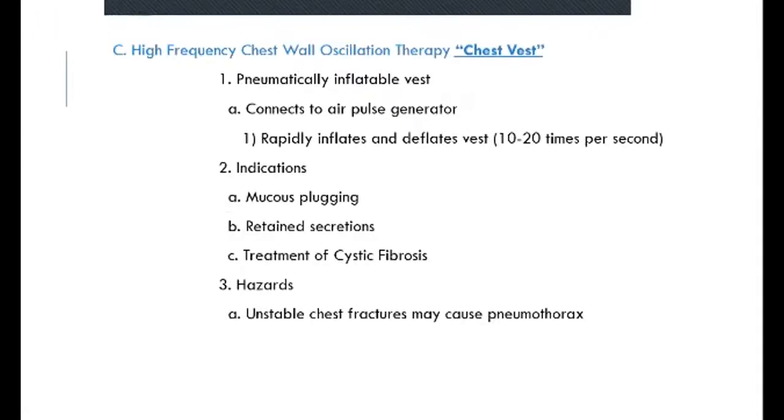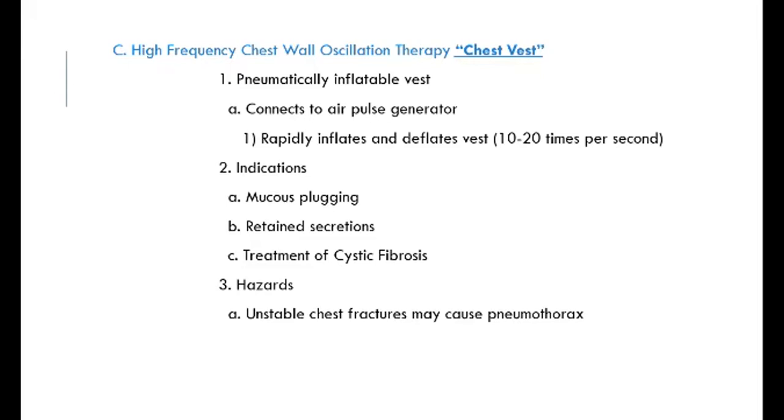Now, high frequency chest wall oscillation. That's the chest vest. This is a pneumatically inflatable vest that connects to an air pulse generator. It fills up around your chest like a bulletproof vest you put on. You hook it up and it fills up with air. When I turn it on, it's going to shake your whole body like this, just like that, but faster.